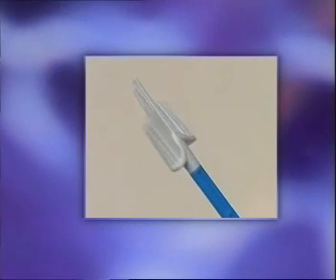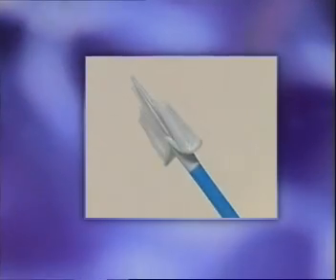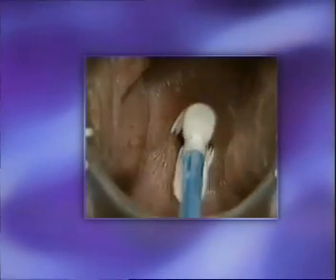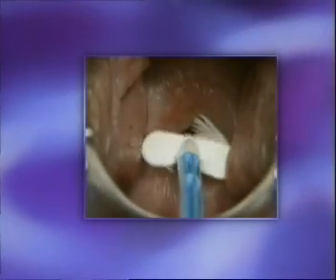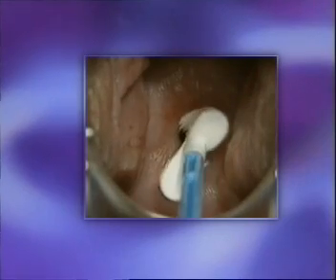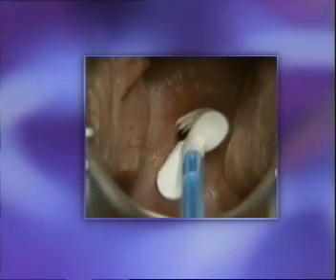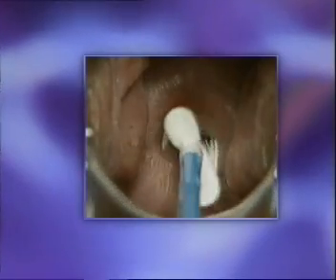The broom-like device is designed to collect ectocervical and endocervical cells from the cervix. Obtain an adequate sample by inserting the central bristles of the broom into the endocervical canal, deep enough to allow the shorter bristles to fully contact the ectocervix. Push gently and rotate the broom five times in a clockwise direction.